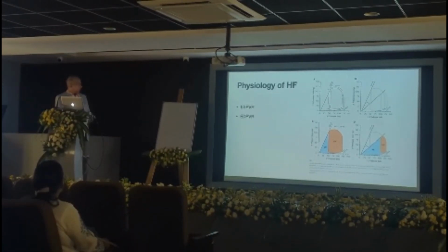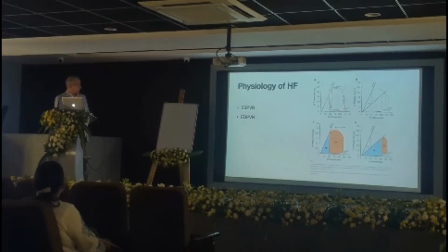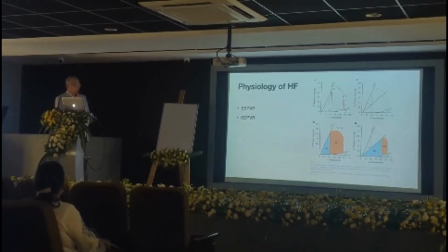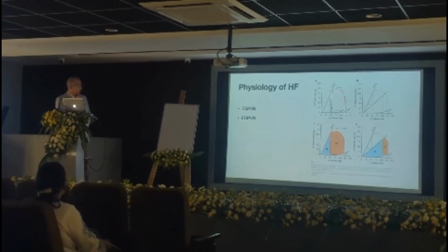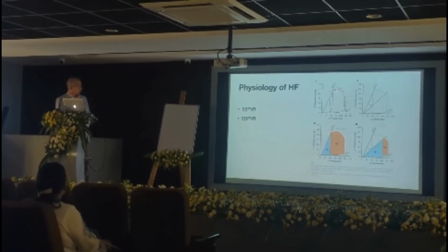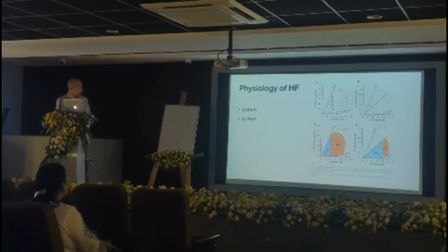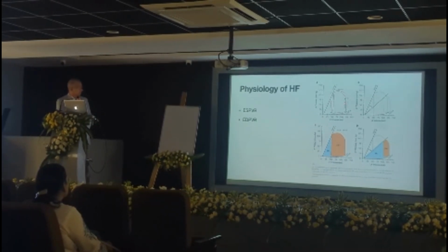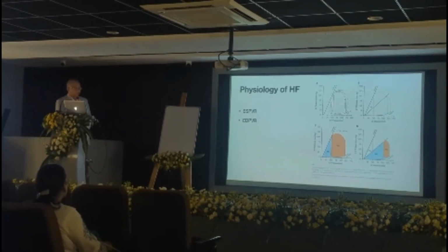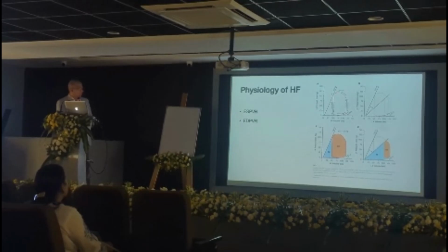So you can see that this is the diastolic phase where the LV is getting filled. Then we have the isovolumic contraction where the pressure increases but there is no filling. And then there is a sudden ejection where the aortic valve opens, and then relaxation where you can see the pressure falls with not much filling. So this is a normal cardiac cycle, the trapezoid shape, which we should know very well; this is the base on which most of our discussions will happen.